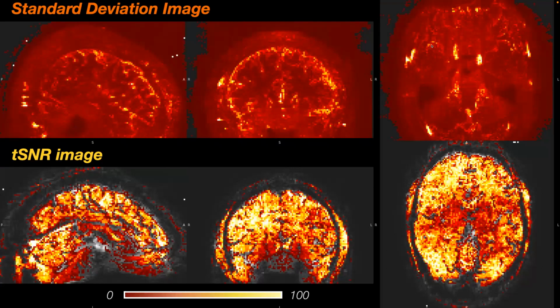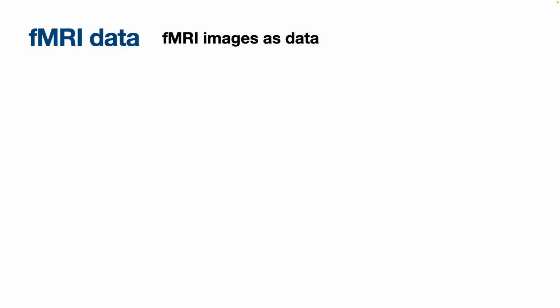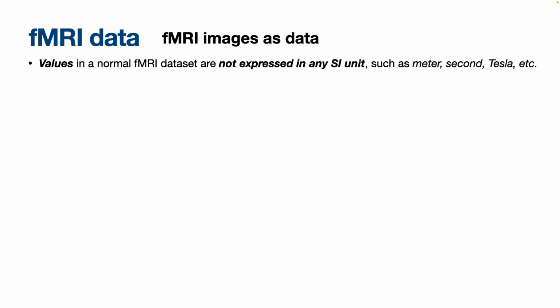Cool. Now, caveat number 4, right? When we see these fMRI images as four-dimensional data, we can visualize them. At the end of the first practical, you'll be visualizing some of these types of images, right? So you can just write a couple of lines of Python code, enter, you see this type of image. Now you can sort of zoom through it. But it's important to realize that when you do this, you have a four-dimensional matrix in some memory in the computer. This is values, right?